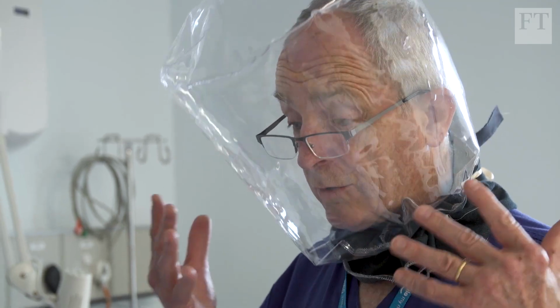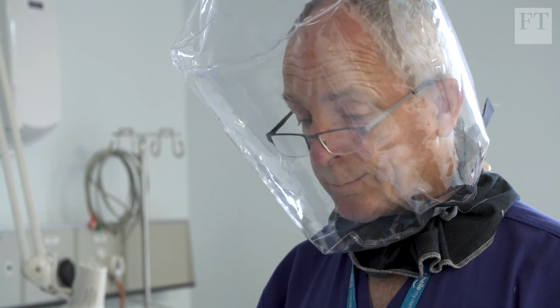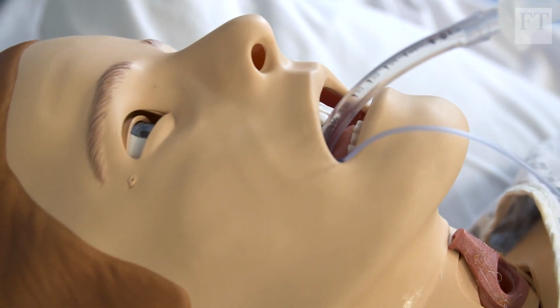You need something that's going to keep you safe the whole time you're with the patient. Yeah, and be comfortable. Yeah. The Trust is now putting Mike's hood forward for clinical trials, starting in operating theatres.